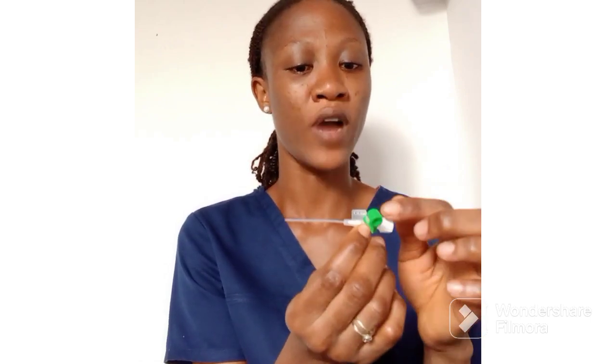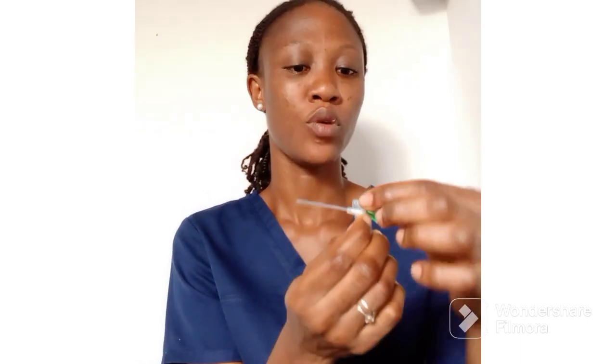This is the injection port — injections can be given to you through here. This cap is used to close it. When I come to give an injection, I give it through this port, and when I'm done I close it. That's all — this is the IV cannula and its parts; it's as simple as that.